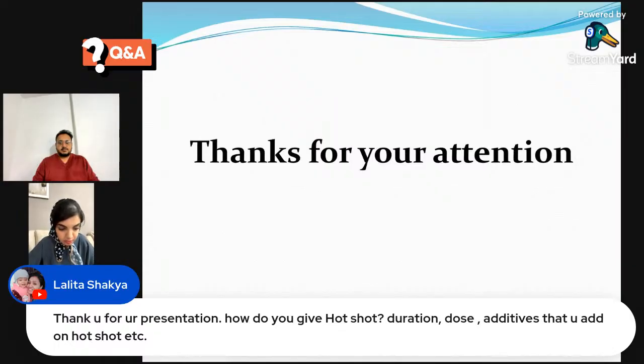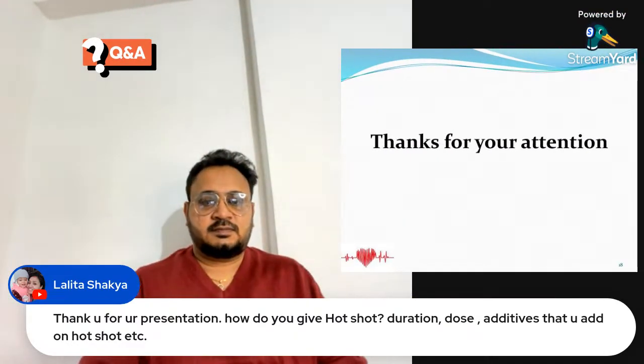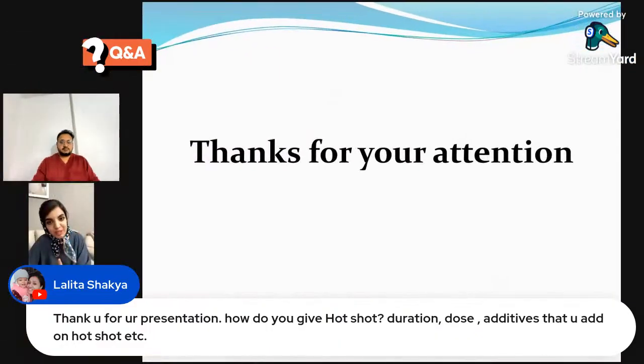The flow duration is, I think, 1 to 2 minutes. We do hot shot in 1 to 2 minutes, and the pressure is 60 to 80 mmHg.